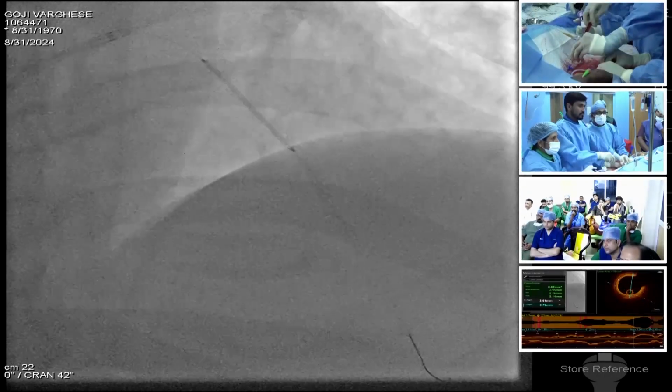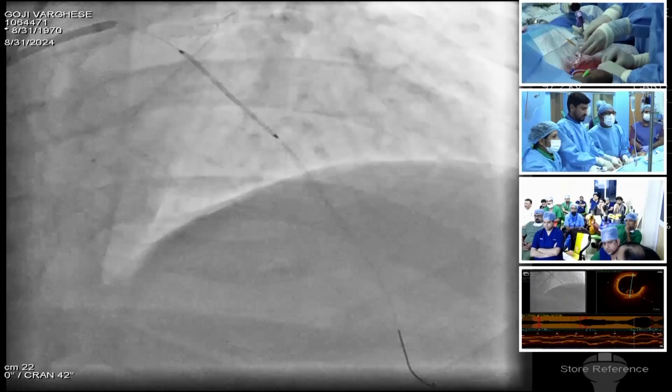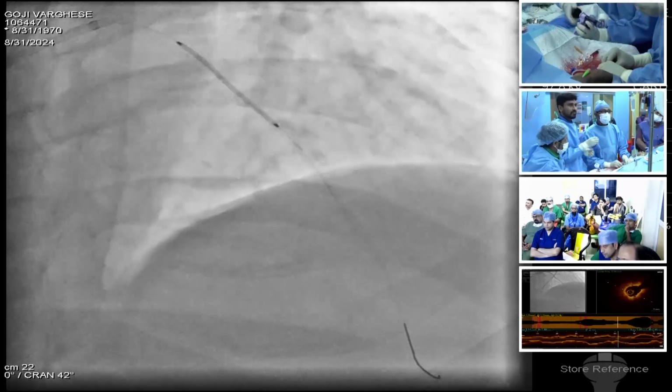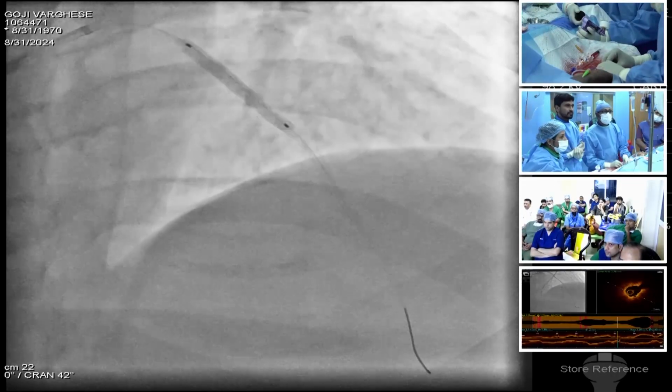That's enough. Now we'll do a cine. Yes, we'll go up. 10, 12, 14, 16. Negative.